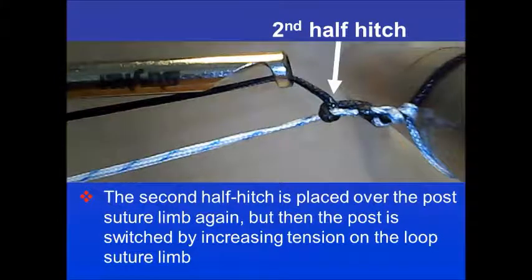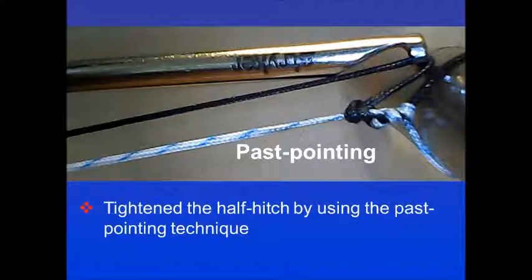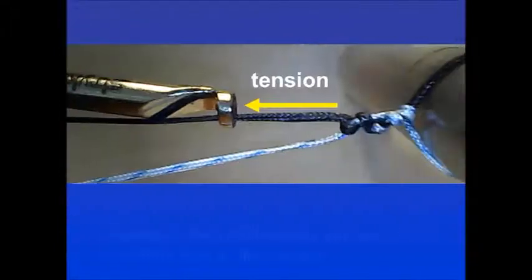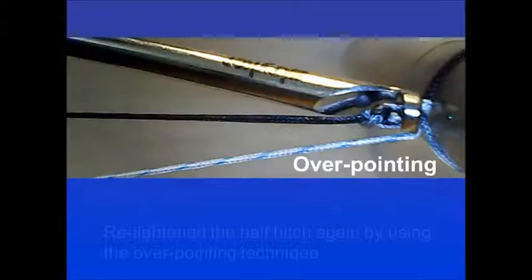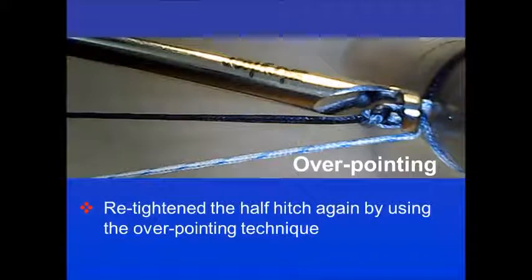The second half hitch is then applied over the post suture limb again, but then the post is switched by increasing tension on the loop suture limb. Re-tighten the half hitch using the pass pointing technique. Tension is then deliberately applied to the post limb until a flip occurs. Once again, re-tighten the half hitch using the overpointing technique.